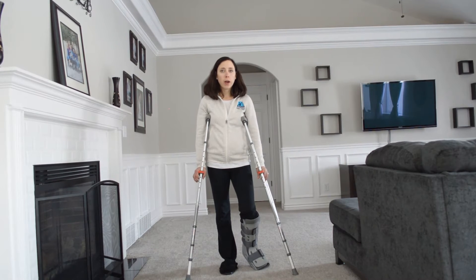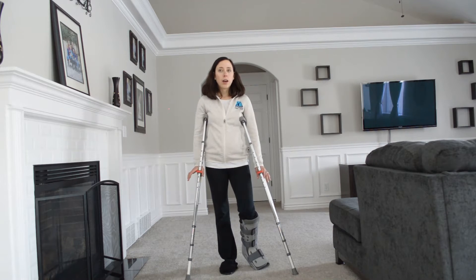Part one video was about weight-bearing or non-weight-bearing use of crutches and appropriate alignment, and this short video is going to be how to progress to weight-bearing using two crutches still.